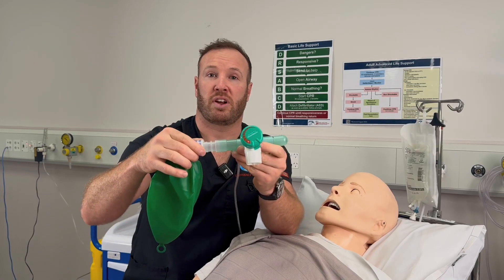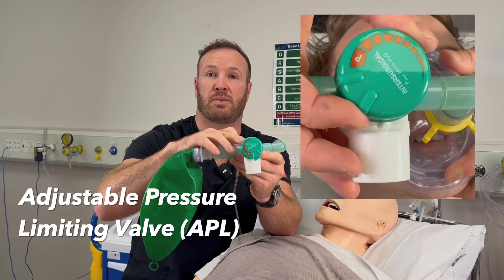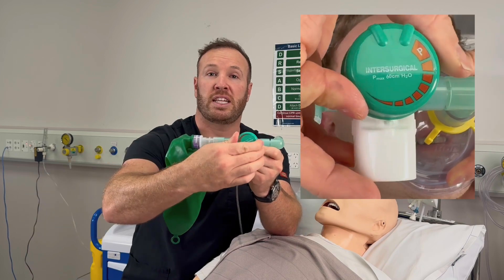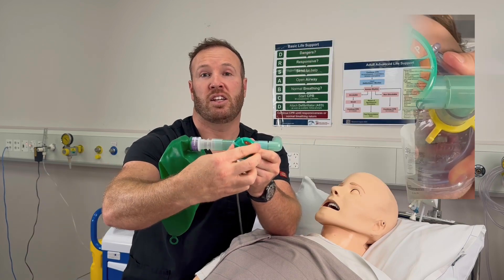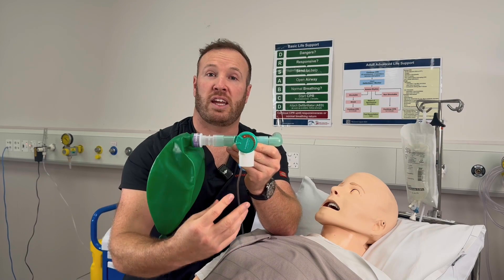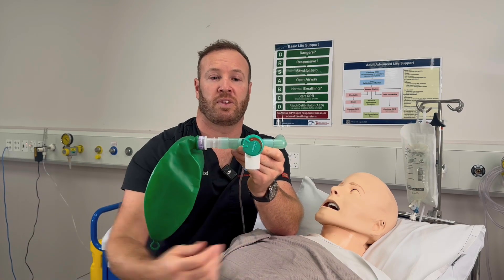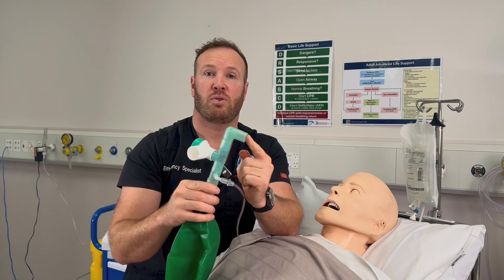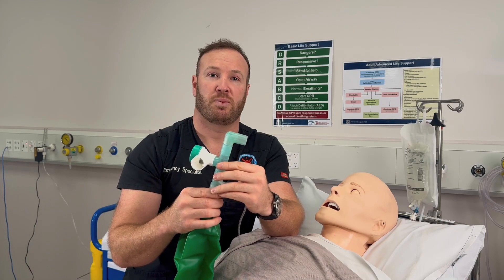We've also got on the front here an APL valve — an adjustable pressure limiting valve. This goes from completely open to high pressure in the circuit required before off-gassing, and this creates a bit of positive end-expiratory pressure. Finally, we have the patient end where we can fit an appropriately sized well-sealing face mask.